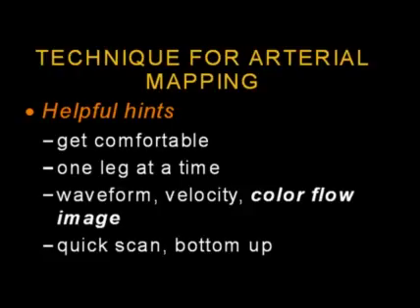Let's quickly talk about some of the techniques for arterial mapping and just go over very quickly some helpful hints. One of the things that I like to say is that the technologist should get comfortable before the start of the examination. These exams can be quite labor intensive, can take up to 60 to 90 minutes to perform, and you really want to be comfortable before you get into the room. Get all the information that you need, all the equipment that is necessary in order to complete the examination. In general, we tend to do one leg at a time, and we inform the patient of such. If the patient requires a bilateral study, we tend to schedule the patient for another day.